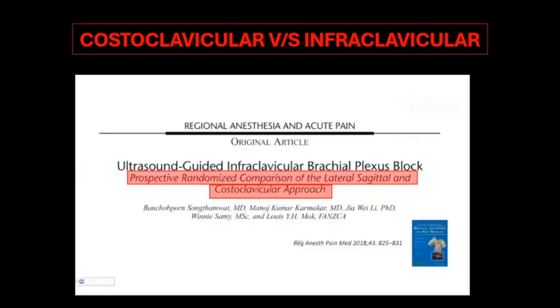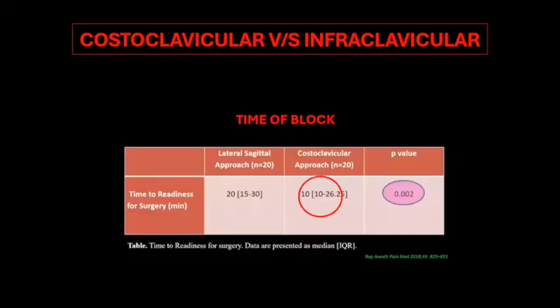A prospective randomized comparison of the infraclavicular and costoclavicular approach done by Manoj Karmakar found that the time to complete analgesic block is less in costoclavicular than in the lateral sagittal infraclavicular approach.